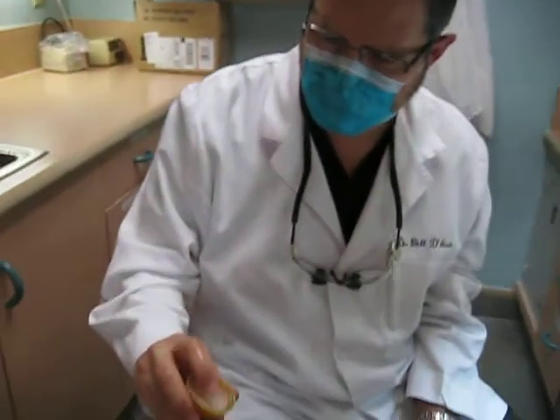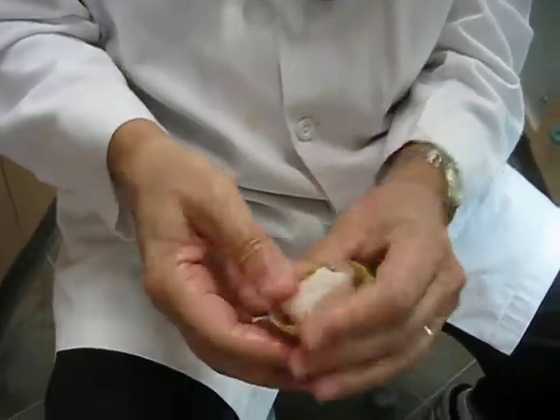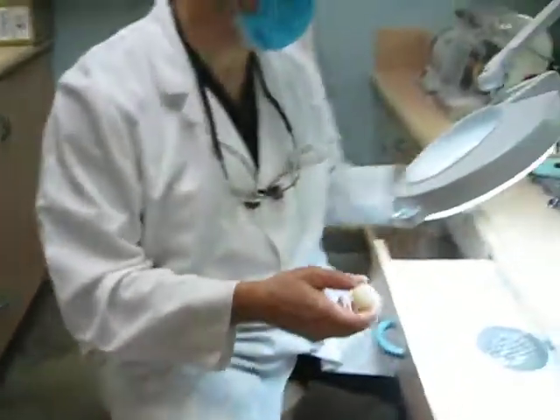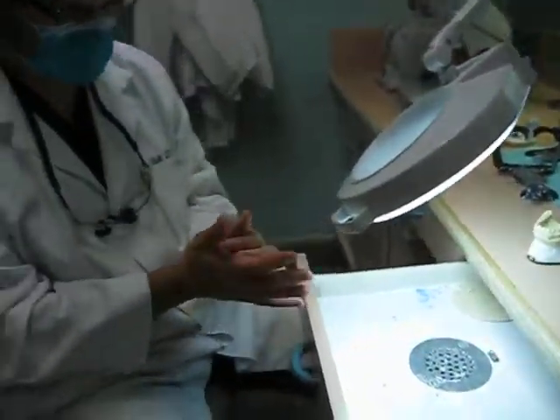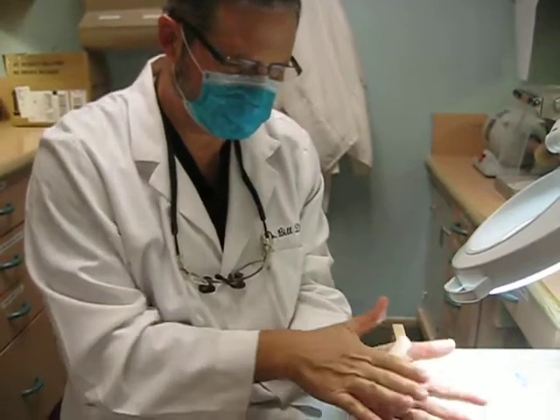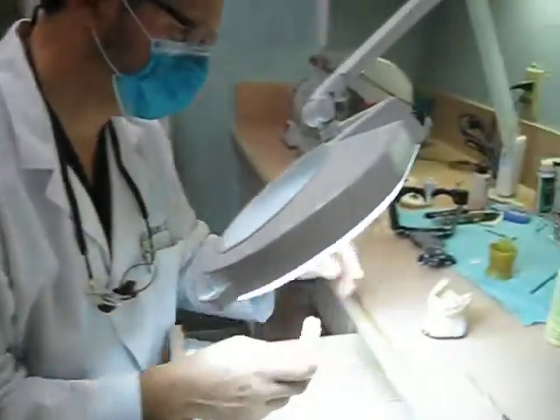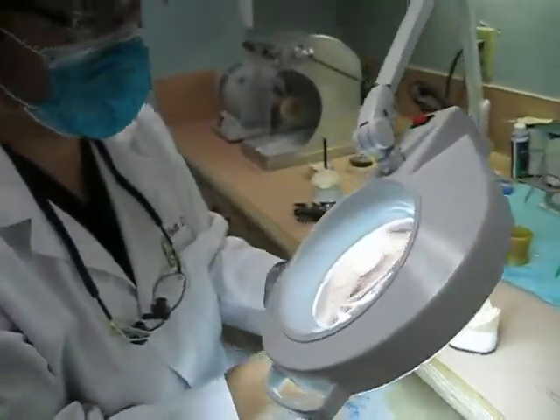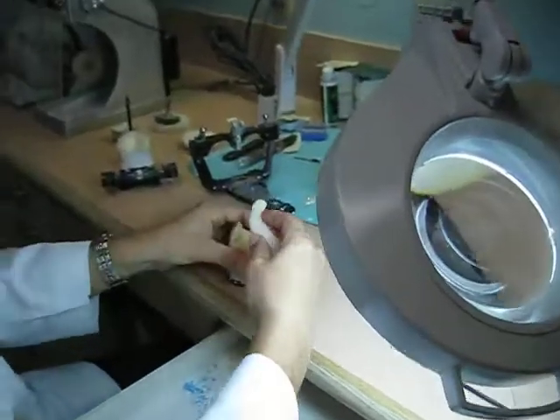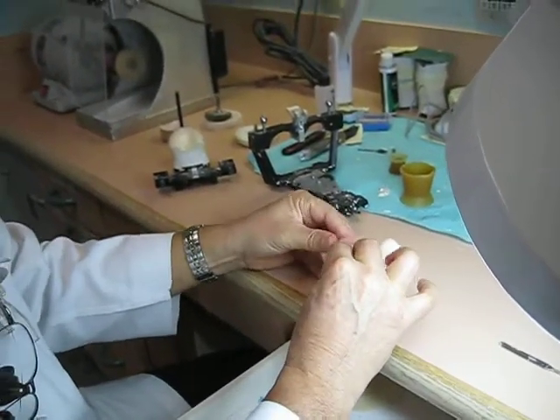Okay, now it's getting to a point where it's giving me resistance. So I get it out of the crucible. And basically, I just roll it into a hot dog of acrylic. And I mold it around the mounted model.